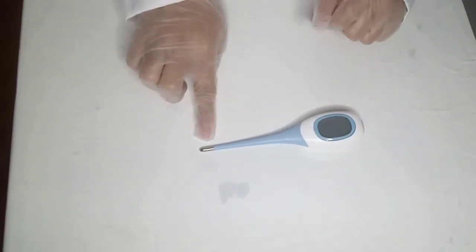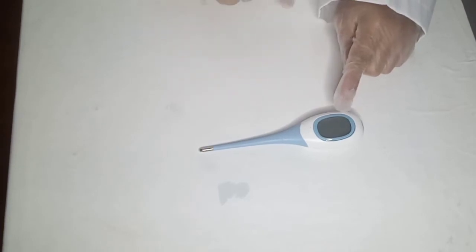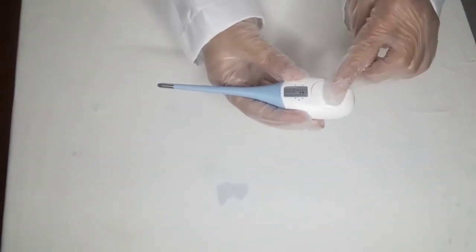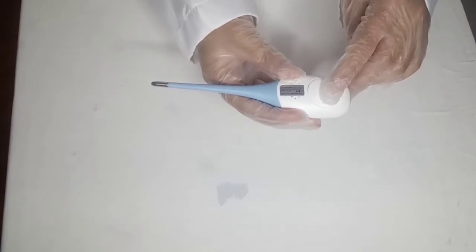Probe tip — it detects the temperature. Display window — it shows the numbers of the temperature. On and off button or power button is where you can deactivate or activate the thermometer. Battery cover retains and protects the battery.